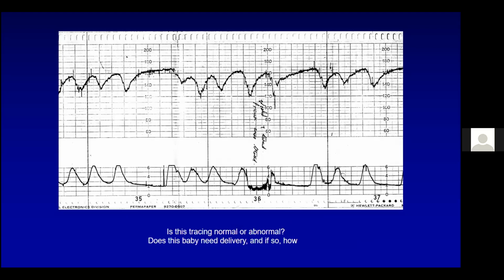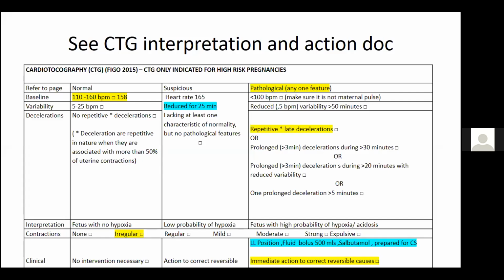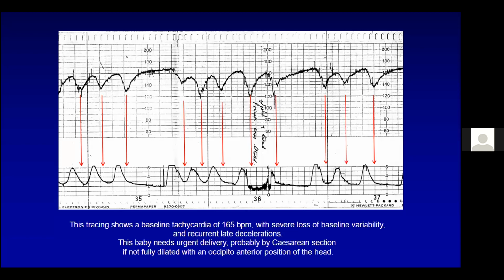Then if you're looking at this CTG, this tracing is abnormal. And what has happened here, you've got late decels, right? So this is just showing you that here's a contraction and the heart rate is slowing. So this is a fetal tachy with late decelerations, right? Okay, so now, we are running short of time, just showing you the CTG and how to complete the sticker on the CTG. So if you're looking at the CTG, right, we can see a contraction and deceleration.